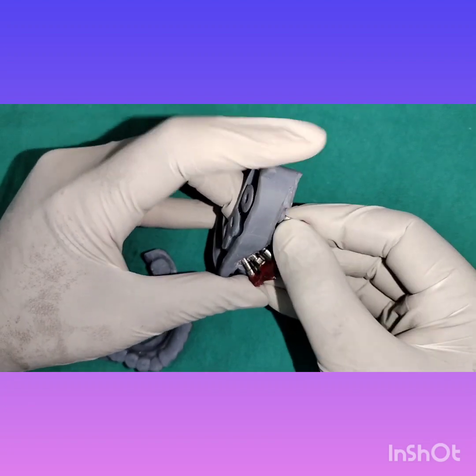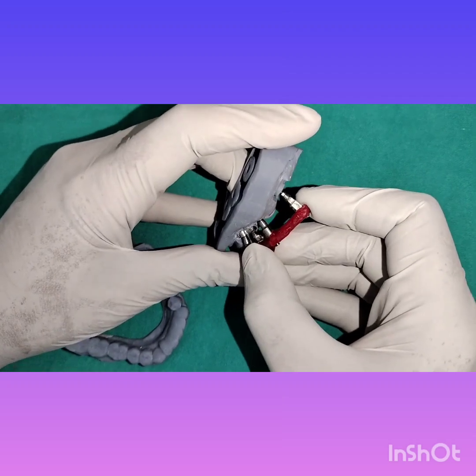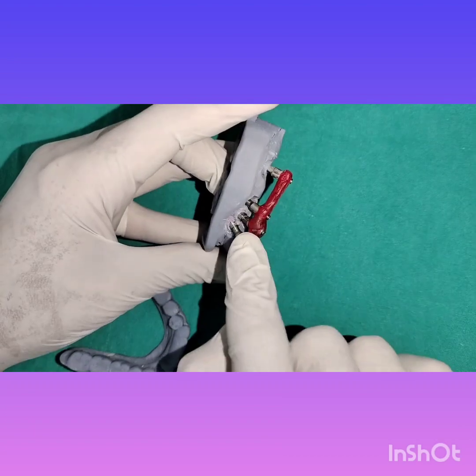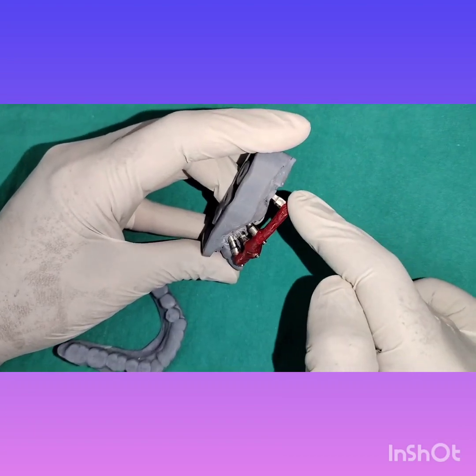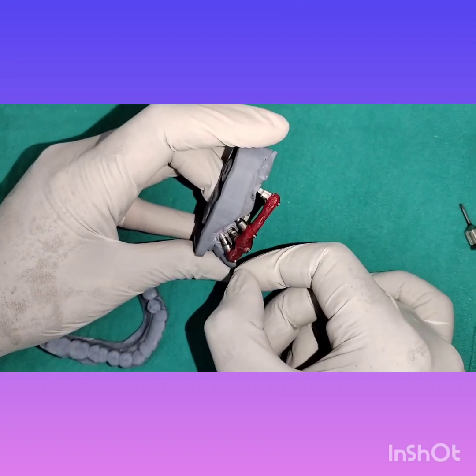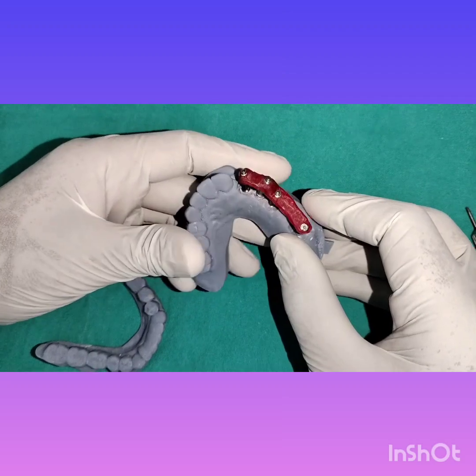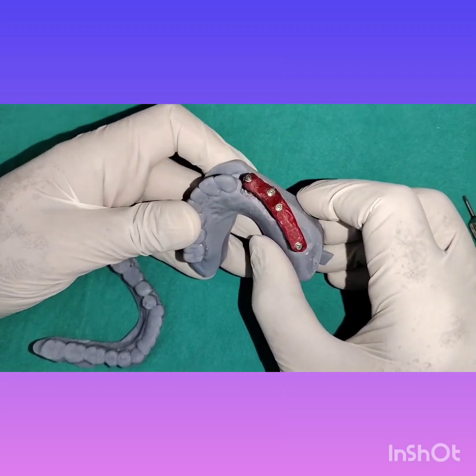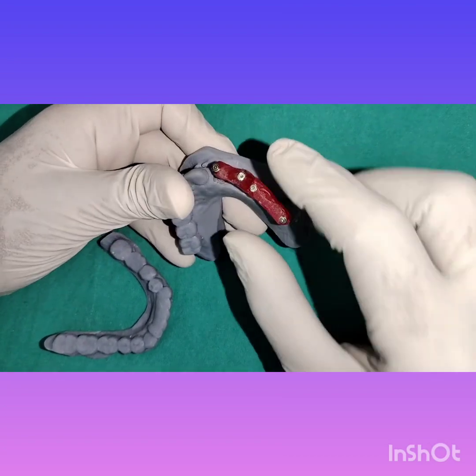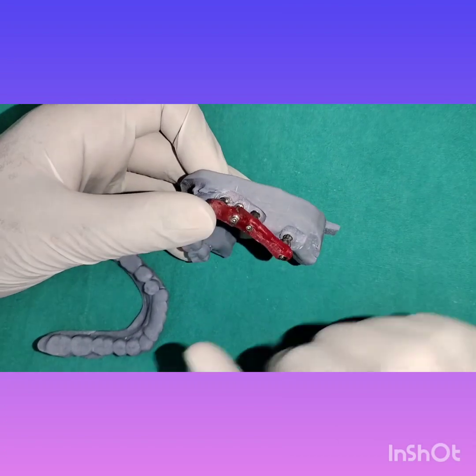Once you know how it is positioned, you can do a good work. This side will go in first and then this side. When removing, this side will come out first and then you pull this out. This is how you are going to do the JIG trial in the patient's mouth, following the same path of insertion and removal.